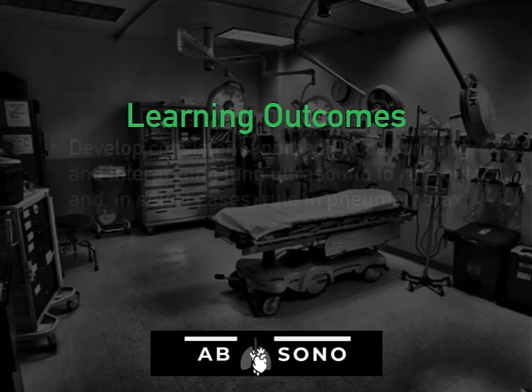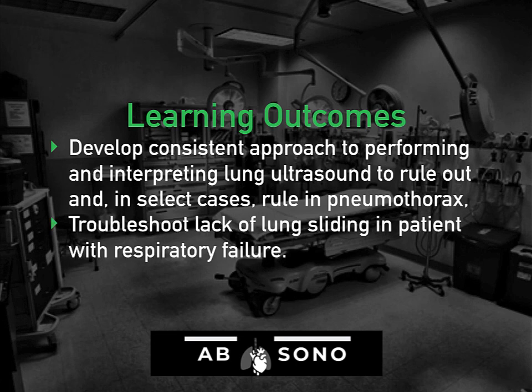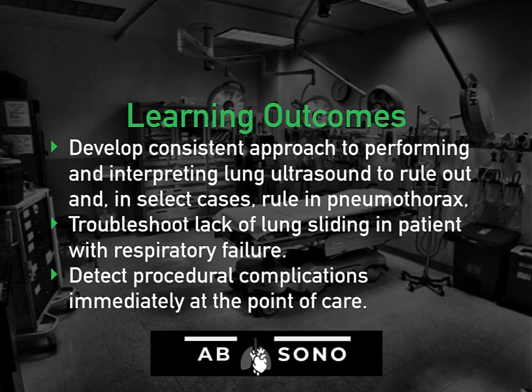Back to our learning outcomes. We talked about developing a consistent approach to performing and interpreting lung ultrasound to detect pneumothorax. We discussed troubleshooting lack of lung sliding in a patient with respiratory failure, including apnea, main stem intubation, pneumonia, and atelectasis. And detecting procedural complications immediately at the point of care in instances of intubation and central line insertion.